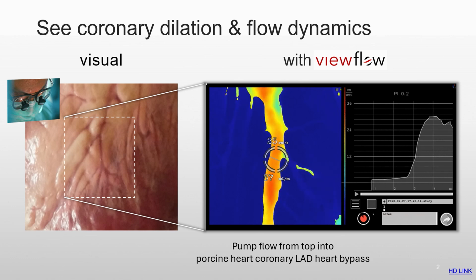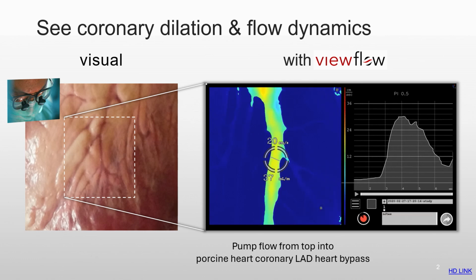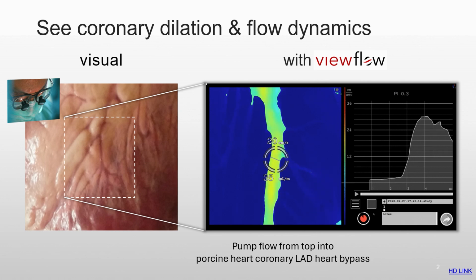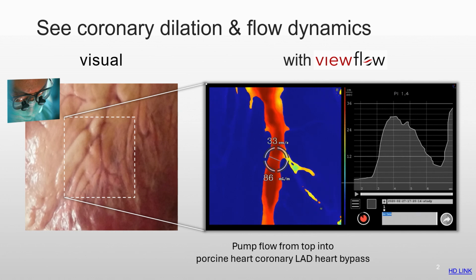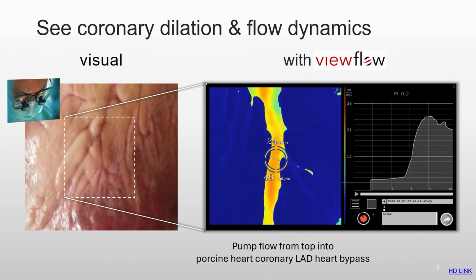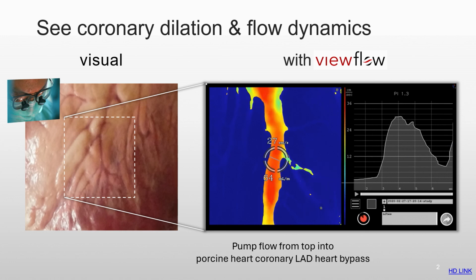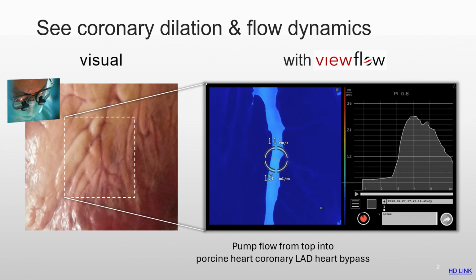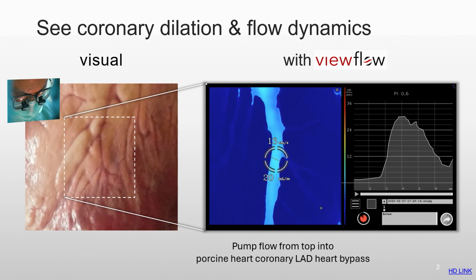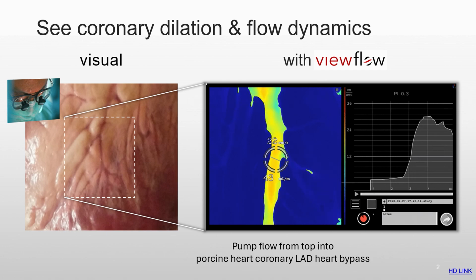The picture on the right shows what Viewflow actually reveals. This is a pig heart explant, so it's bench top. We're pumping blood from the top through the coronary. In this case, we wanted to get to much higher speeds, like 31 centimeters per second, and to get to that on a pig heart that's been harvested, we had to cut the lower part of the coronary. So basically it's just coming right through, and it's not going through the other vessels to the left and the right. The picture on the left, of course, is what a surgeon sees without the aid of some type of system.